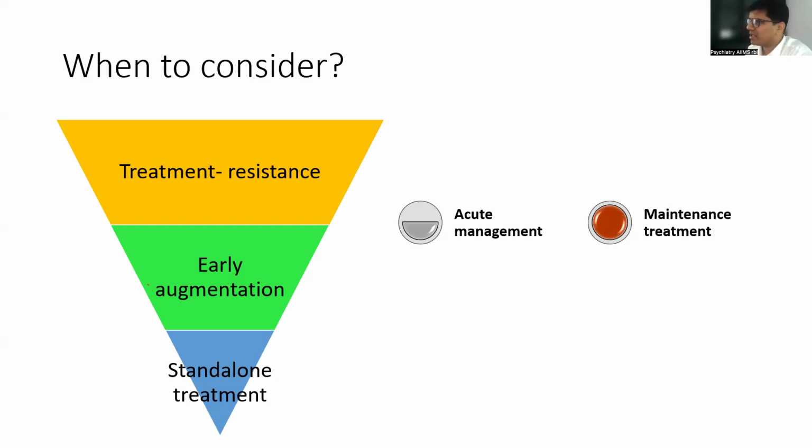If you are talking about depression, OCD, all those cases, the recommendation is to use rTMS if there is a failed trial of antidepressants, multiple trials of antidepressants and psychotherapy in depression, and if multiple anti-obsessive medications have been tried in the treatment of OCD, and a behavioral intervention like exposure response prevention has been tried and was unsuccessful. In that scenario, you can consider rTMS, but it is not a hard and fast rule to wait for treatment resistance. There is some evidence that you can start early in the course of treatment.